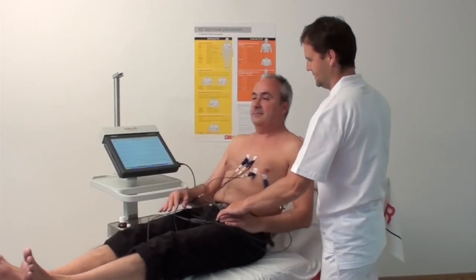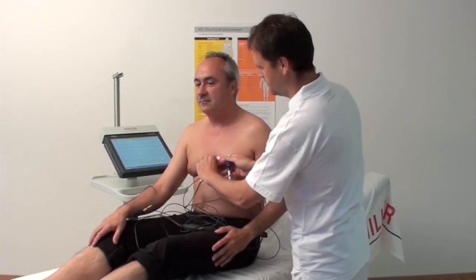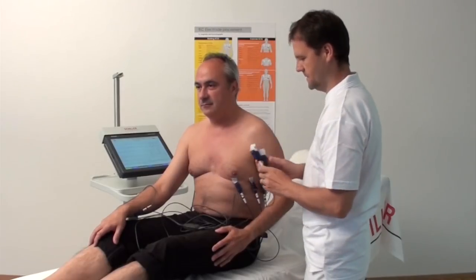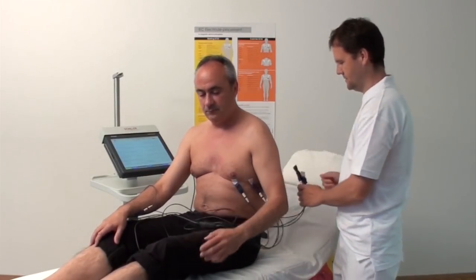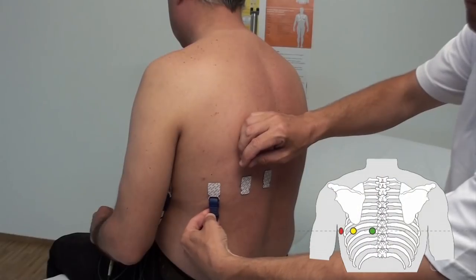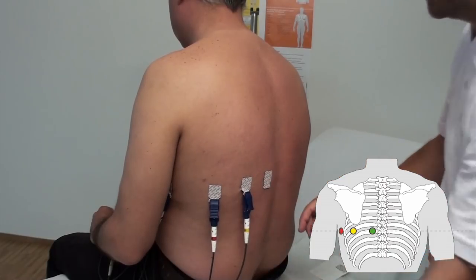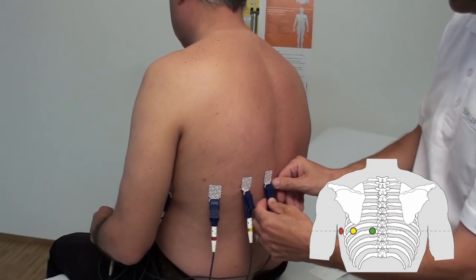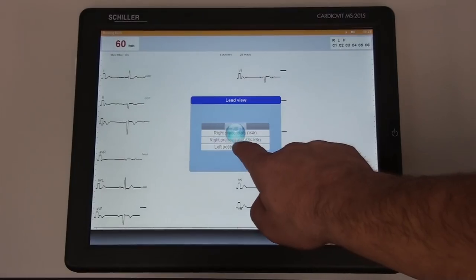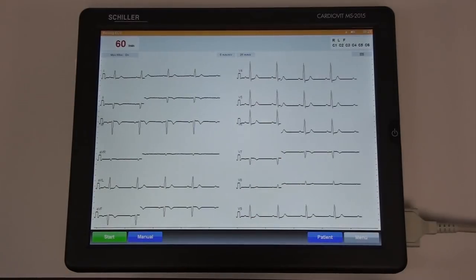Posterior leads are recommended if an acute coronary occlusion is strongly suspected due to clinical results and anamnesis, or in the case of persistent symptoms. The electrodes C1 to C3 need to be repositioned as follows. C7 Red, on the posterior axillary line. C8 Yellow, on the scapular line. C9 Green, on the paravertebral line. Check the ECG signal on the screen and ensure that a good signal is displayed.